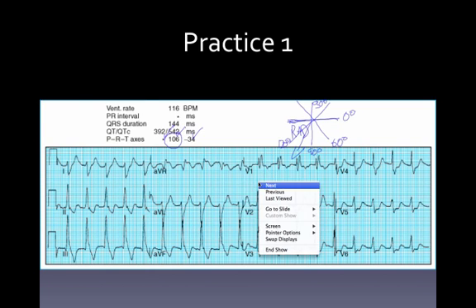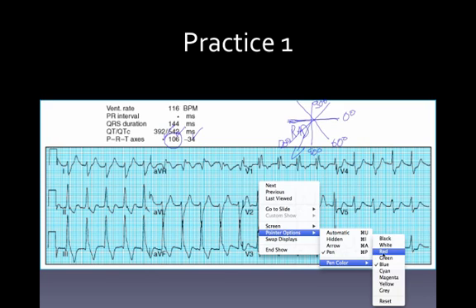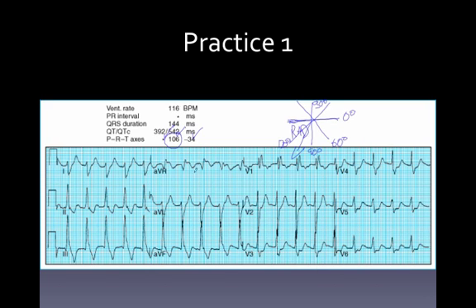I'm going to switch pen colors here really quick, back to, say, a red. So the machine says, and this is a down, up, up. The isoelectric line's there. Is most of this QRS above or below? It's below. This one, is most of this QRS above or below? It's above. Is most of this QRS above or below? It's above. So down, up, up. So lead 1's perspective is it's going away from it.